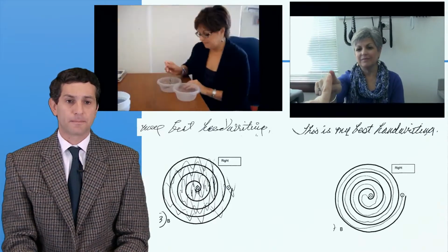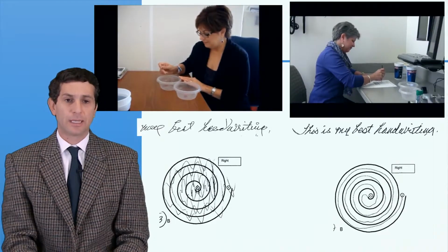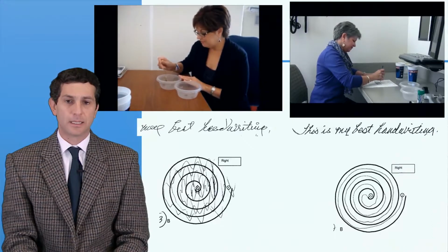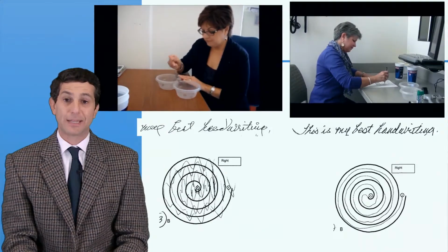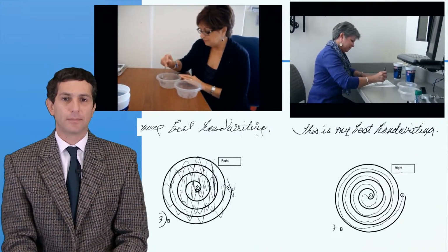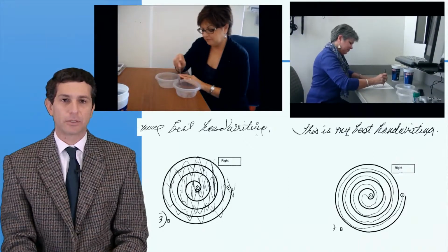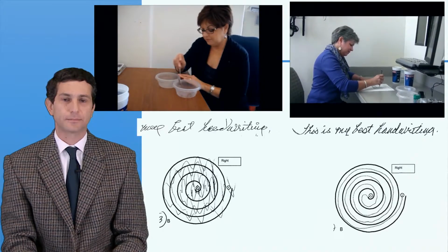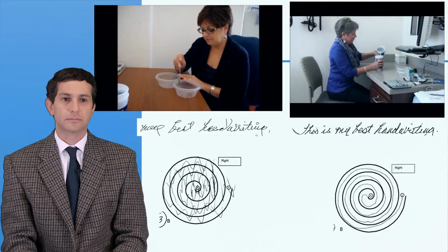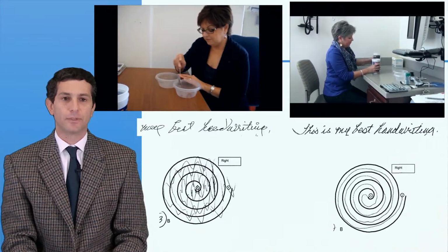The spiral drawings and the handwriting samples nicely illustrate the difference between baseline tremor level with essential tremor and the alleviation of the tremor after the focused ultrasound thalamotomy. You can see the pouring task is nicely improved also.